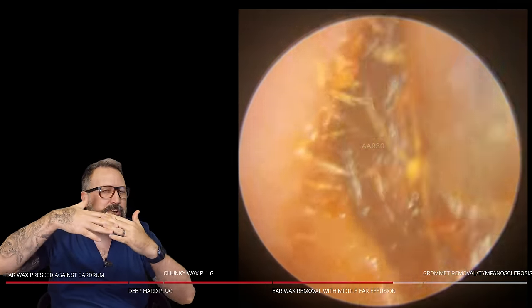Make sure you stay tuned — I put these two videos back to back because it's easier to show: this is middle ear effusion, and then this is the sort of thing they can put in to help. We've got a bit of a thicker plug on this side — removing that now. Let's tidy up the entrance; this is more cosmetic wax and not going to cause problems with day-to-day hearing. It does look a little bit retracted, and that light reflex is just a little bit more dispersed. Two centimeters — three quarters of an inch on that one.